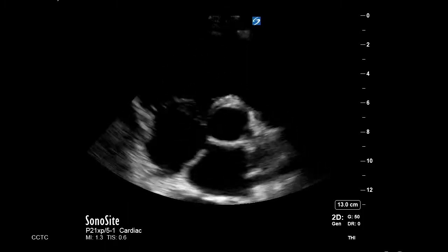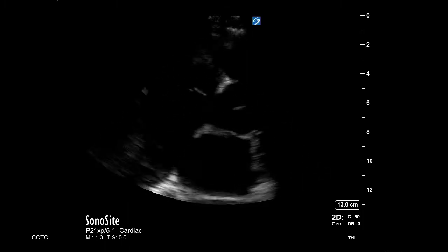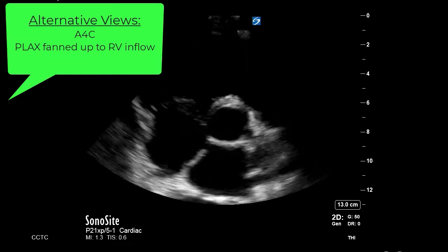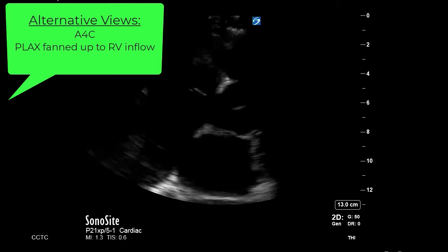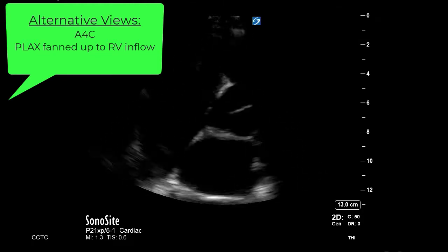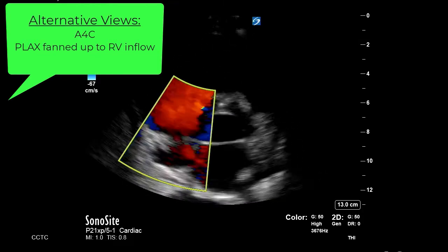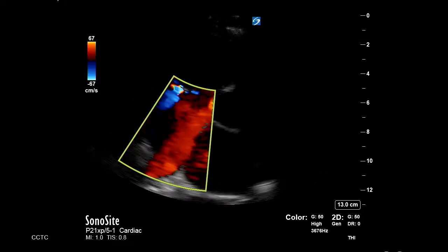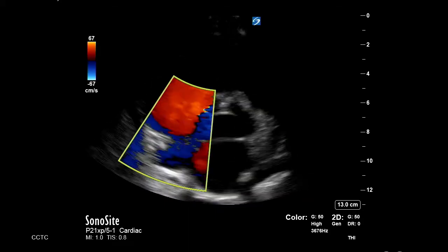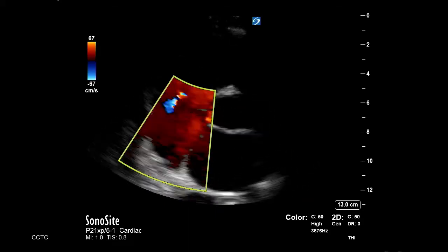To quantify TR, you're going to need to obtain the short axis view at the level of the aortic valve as seen here. You want to apply a color box and look for regurgitant flow, which will appear blue as it's going away from the probe.